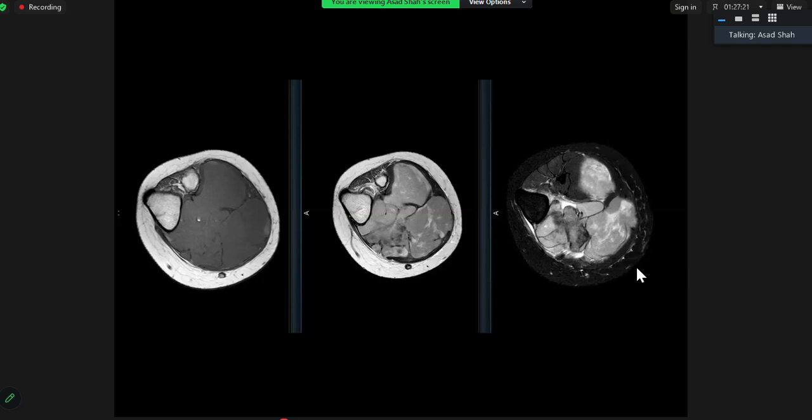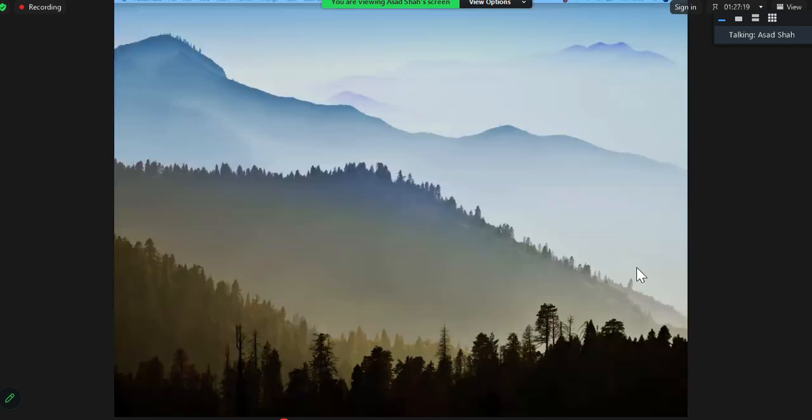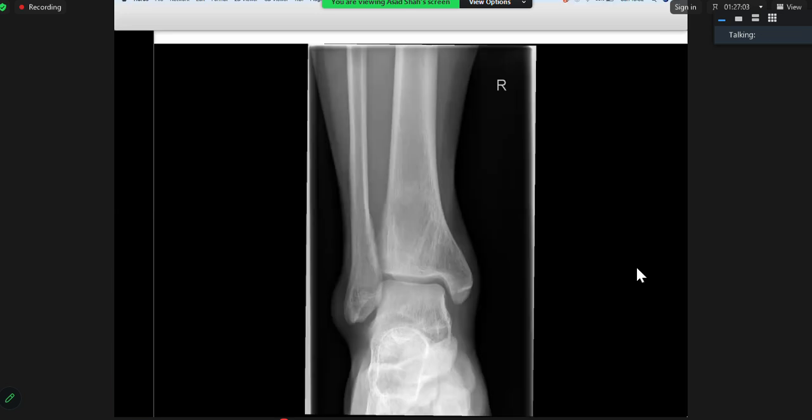Let me solve it now. I'm just going to come out of this PowerPoint. I've got all the cases, but I think let's just change the mood of it. Let me put this image there. Okay, good.